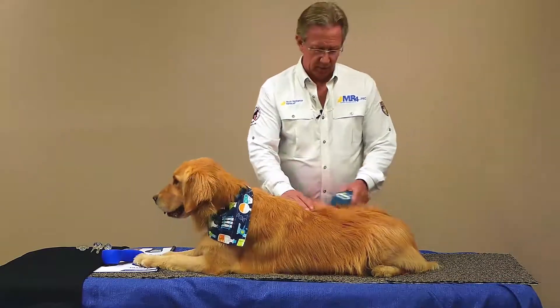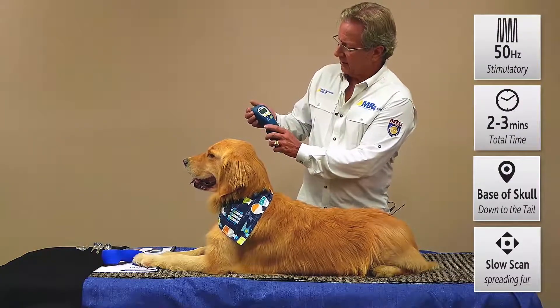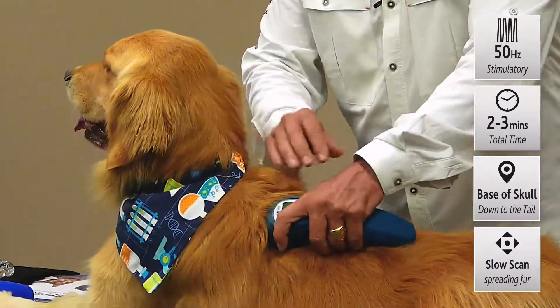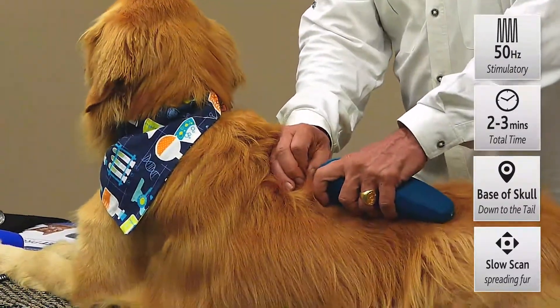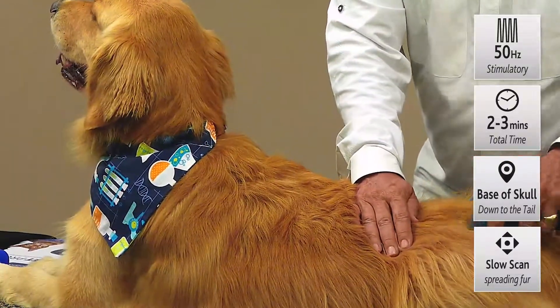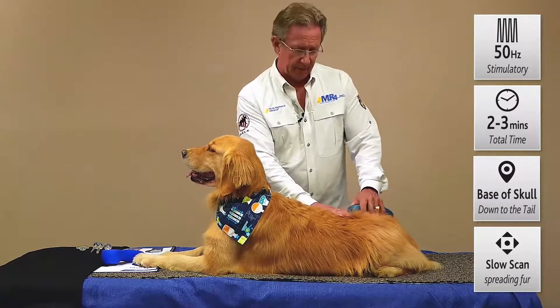The other kind of unwind protocol would be with 50 Hertz to stimulate blood flow — in these older dogs sometimes it's really nice. We just step it back, come back to 50 Hertz, press select. We're on the 10 minute timer which is perfect. Push the start button — that's when we want to increase metabolism in these tissues, improve blood flow. We're not looking for pain inhibition with 1000 Hertz; we're looking to stimulate with 50 Hertz. What that's doing is photodissociating nitric oxide into the blood — a natural vasodilator which improves circulation in those micro capillaries and improves metabolism by bringing nutrients in, getting waste products out.